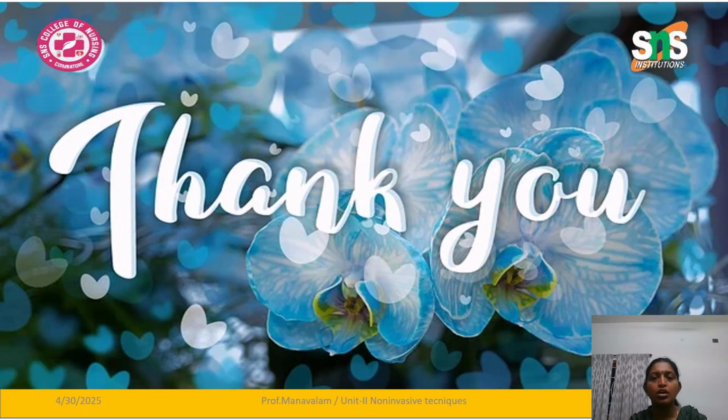Thank you all. We have seen in detail about cardiotocography, the machine commonly used to monitor the fetal heart rate and uterine contraction during pregnancy as well as the labor period. The machine used for this is called a cardiotocograph.